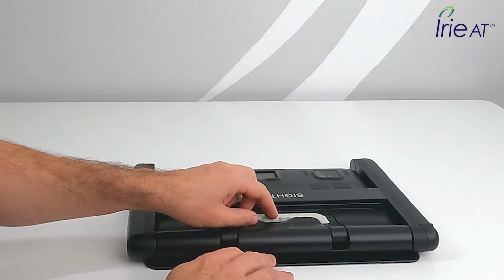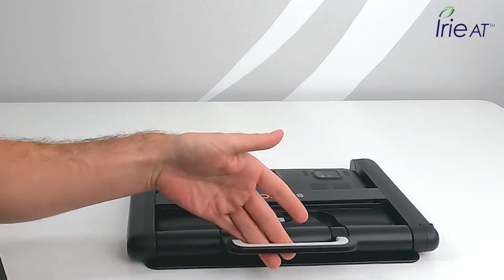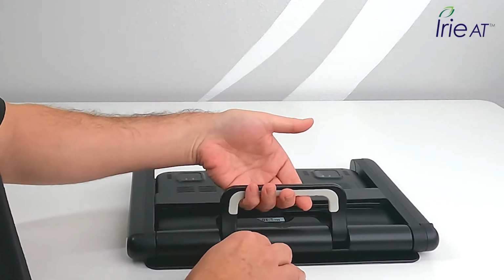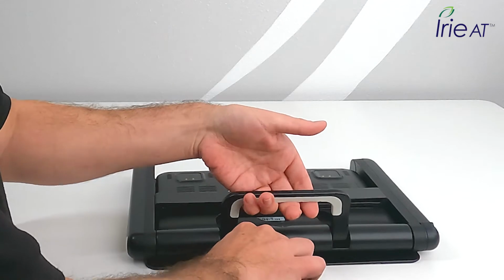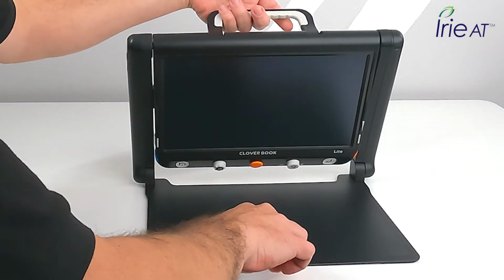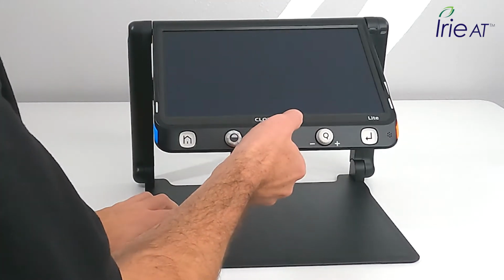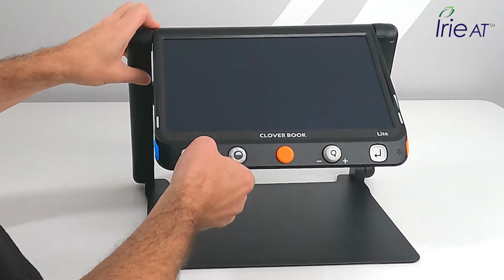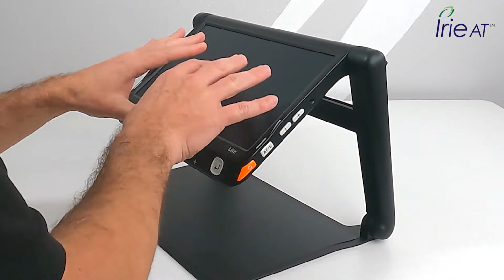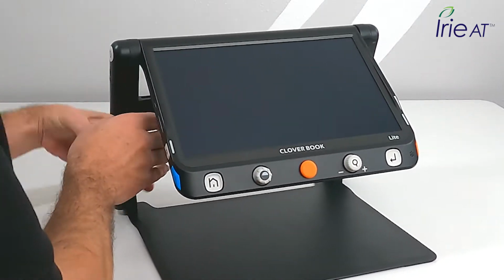So let's take a look at this guy here. First of all, we're going to use the handle again, the handle that I pulled it out of the case with. All I have to do is grab onto that. I'm going to put a couple fingers on the tray and lift up. And when I get to the angle I want, I can go to whatever angle. And I can just lift out the screen. And I have a nice, comfortable reading angle. Put my reading materials underneath it. Read right through there. Makes it nice and easy.